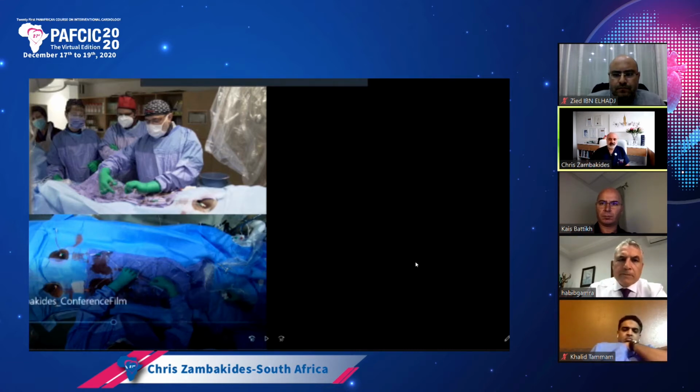So I changed to the Sion Black, which is my favorite wire. But sometimes you have to go with something a little bit more tapered, like an XTR, or sometimes even the Fielder FC. So it all depends. Everyone's going to have their favorite or the wire that they prefer, but that's my choice as I go along.